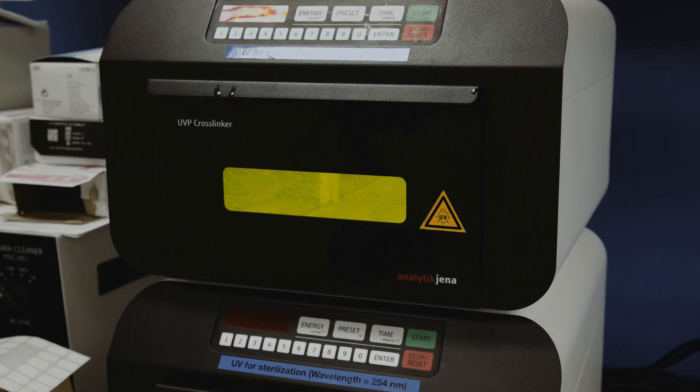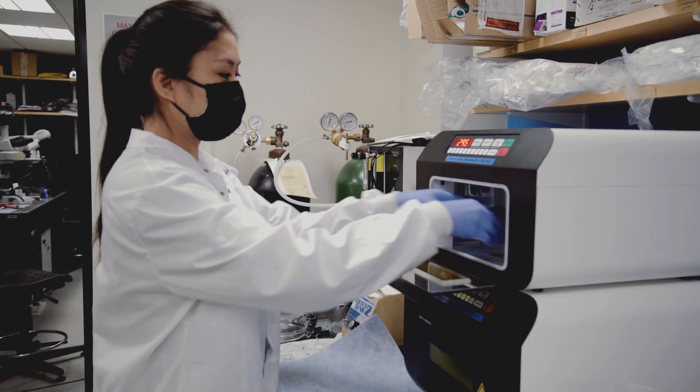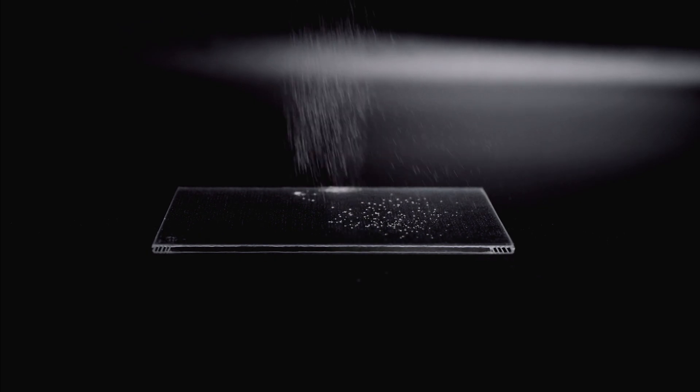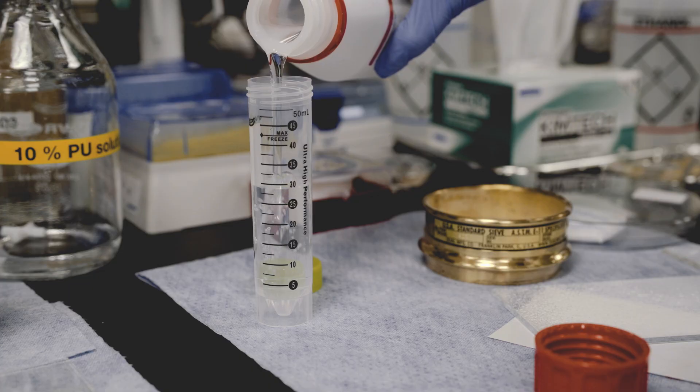The sticky layer of the patch is based on a bioadhesive material which contains functional groups that can covalently bond with tissue surfaces. One surface of the patch is embedded with microparticles comprised of this material, then infused with a slippery fluid layer.